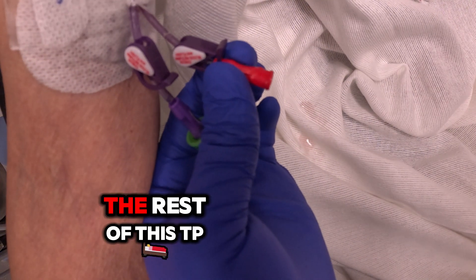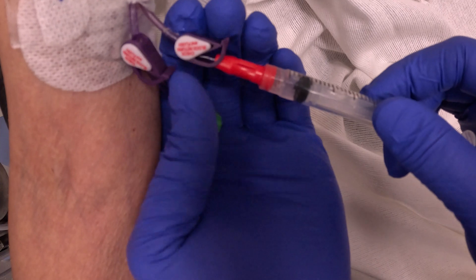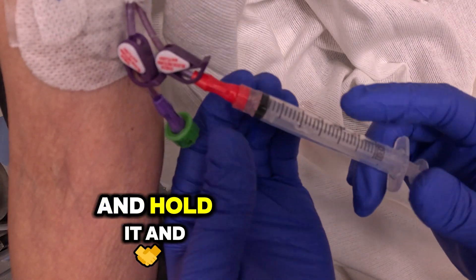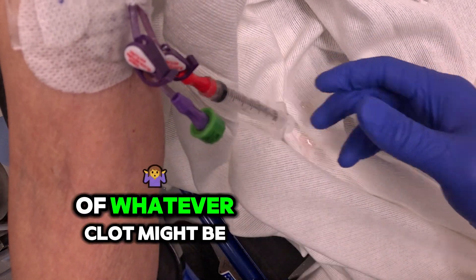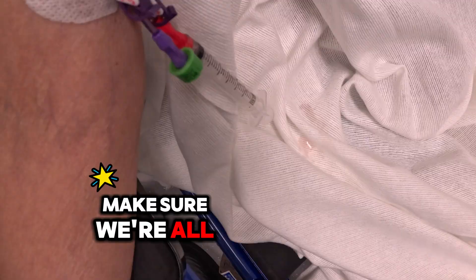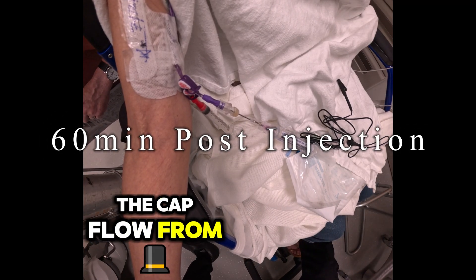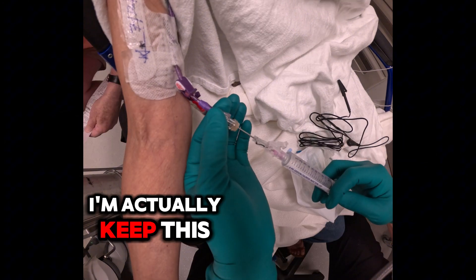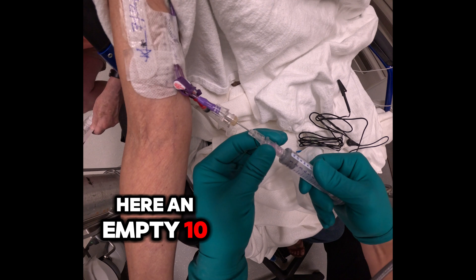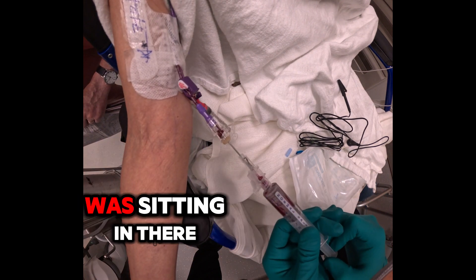We're going to give the rest of this alteplase and administer the rest of it, hold it, and try to get rid of whatever clot might be left over. So we're going to do another 15 minutes just to make sure we're all done. We're going to pull back the cath flow from that site — I'm actually going to keep this here. Get an empty 10 cc syringe, flush, and aspirate whatever was sitting in there.